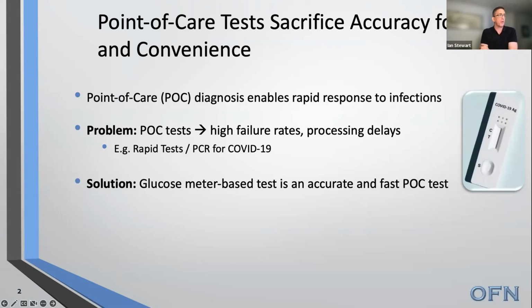Although it's possible to sample from a patient at the site where they are, the processing of those samples in some cases requires them to be sent off to labs and causes quite a lot of delays, whether it's done on site or in a lab somewhere else. And more importantly, the analysis often requires very expensive readers and technologies that make it quite expensive.